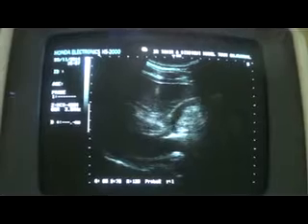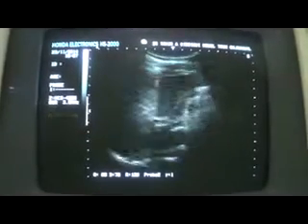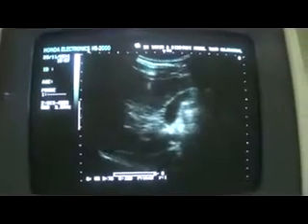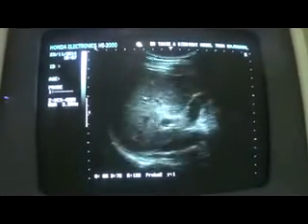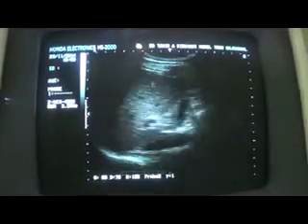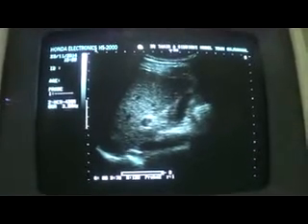This is a good view of the gallbladder in this patient who is not on an overnight fast. So these are a few maneuvers that you may use for the study of the gallbladder. Now I am in the intercostal space, maneuvering a bit and seeing a full view of the gallbladder. Thank you very much.